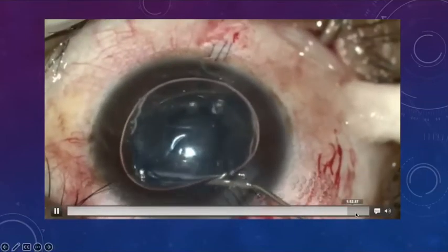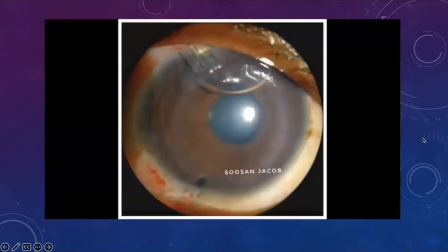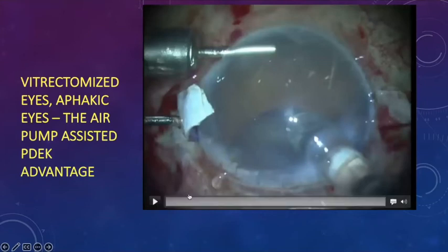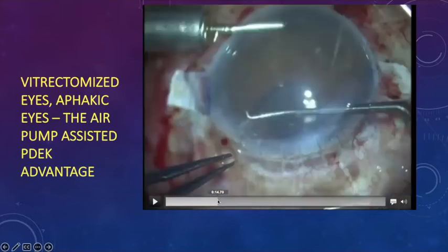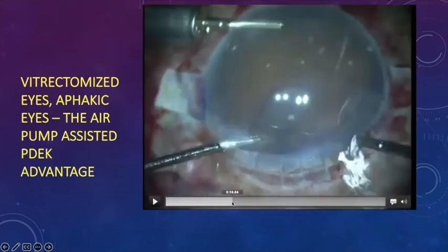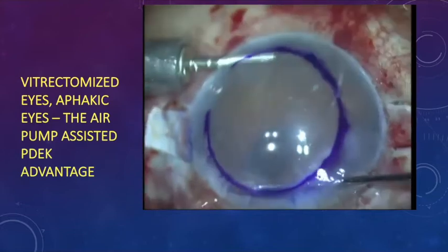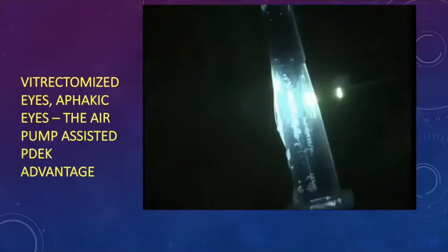Now we've put an 80% air bubble since she's phakic, and this is the first post-operative day appearance of the patient. We can do it for vitrectomized eyes, as I said, PDEK. Now, these are all situations where you would not consider doing a DMEK because these are areas where you might get a DMEK detachment, and you would possibly consider doing a DSEK in these cases. But we've completely stopped doing DSEK and DMEK. We do only PDEK as our only endothelial keratoplasty procedure in all cases, irrespective of the indication.